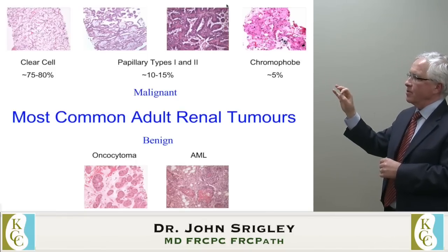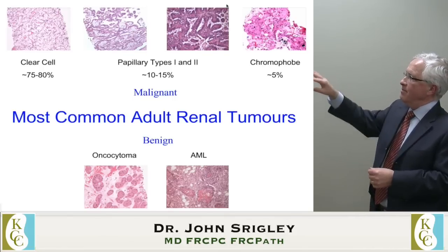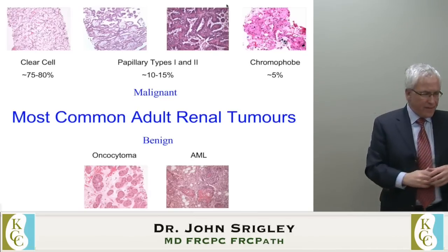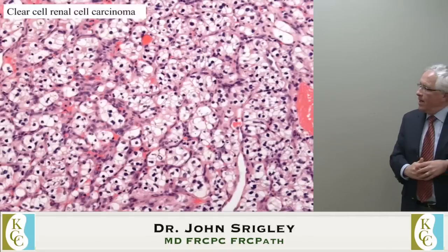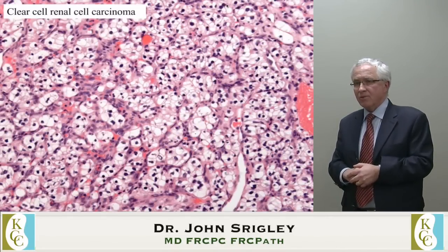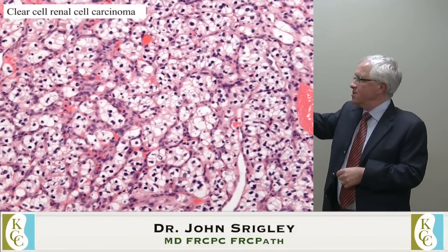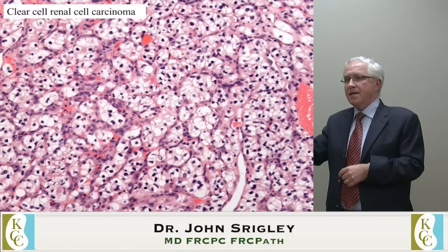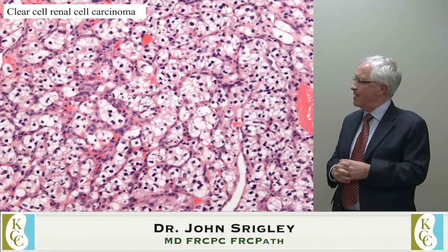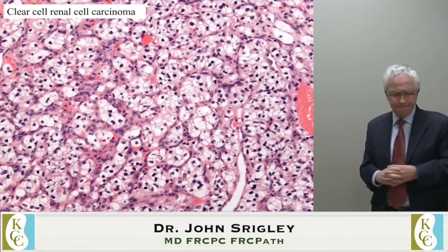So this is what we spend most of our career learning through our residency programs, our fellowships, and through our practices, seeing many different examples of these types of tumors, and that's sort of the whole art and science of pattern recognition. Now, this is just an example of a very typical clear cell carcinoma, kidney cancer. And as Dr. Getty mentioned, in the background of that kidney cancer, there's tons of little wee blood vessels. And that's why the VEGF inhibitors are important in terms of being able to attack those vessels so that tumor can't grow and expand any further than it is.